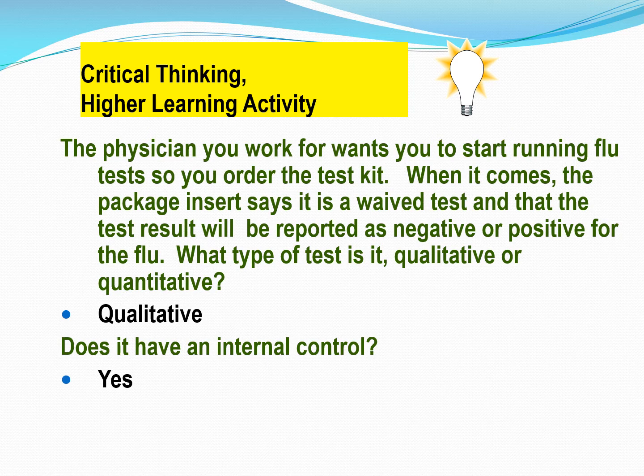Yes, every one of these kits like this, whether it's for mono or the flu or for a pregnancy test, is going to have a built-in internal control that if that built-in internal control does not work, you cannot accept those results and you have to take corrective action.